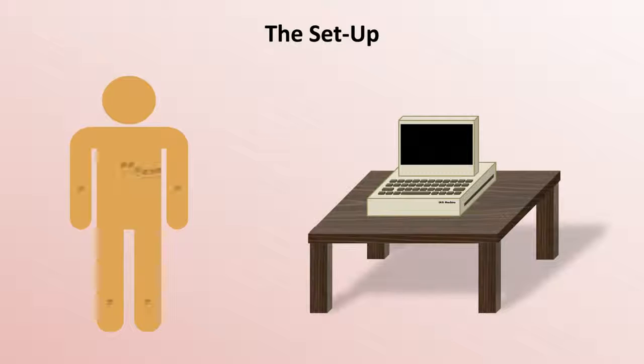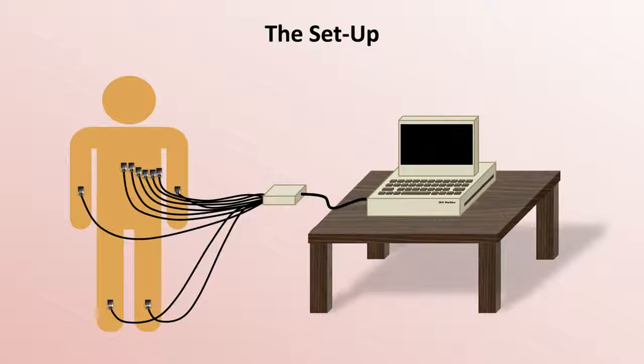Now the patient needs some electrodes. As mentioned earlier, a conventional 12-lead EKG uses 10 electrodes. These usually look like rectangular black stickers, one on each limb, and 6 across the anterior and left lateral chest wall. Each electrode is connected by a separate wire to a junction shown here, which then connects to the machine. The electrical recording then shows up on the screen, and if satisfied with the quality of the data recorded, the clinician can print a hard copy, usually on red or pink grid paper.